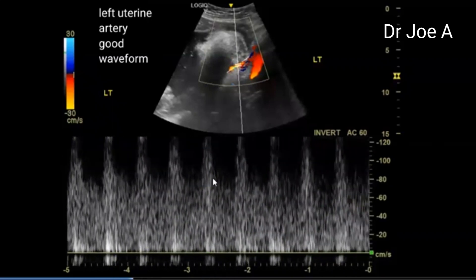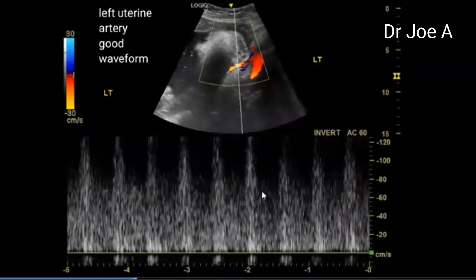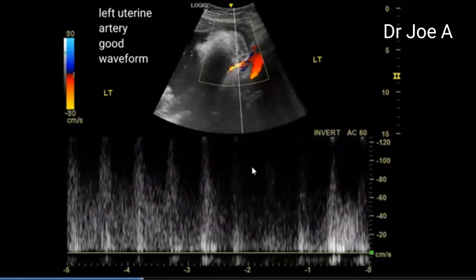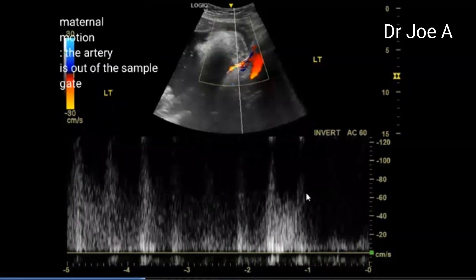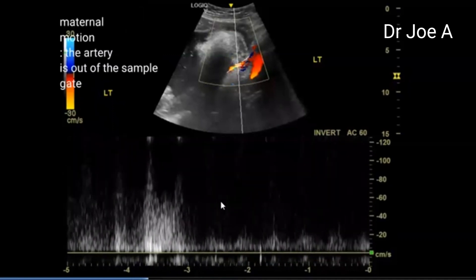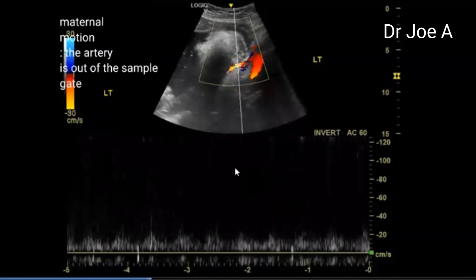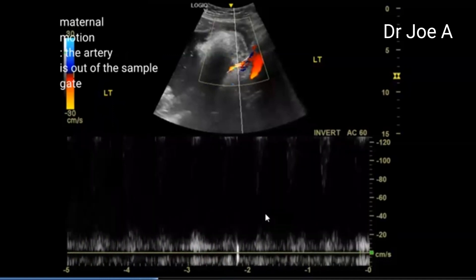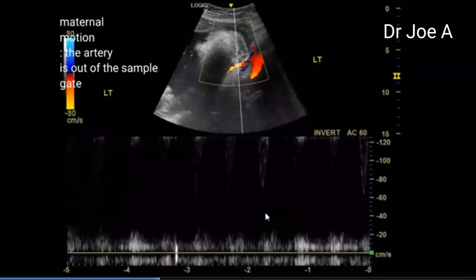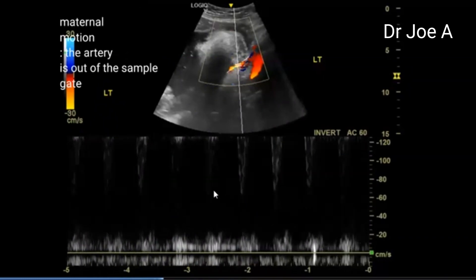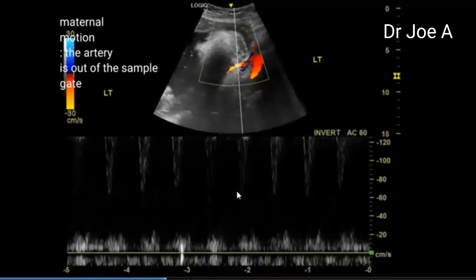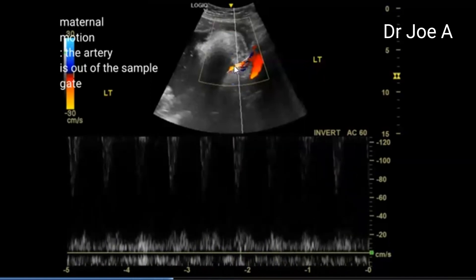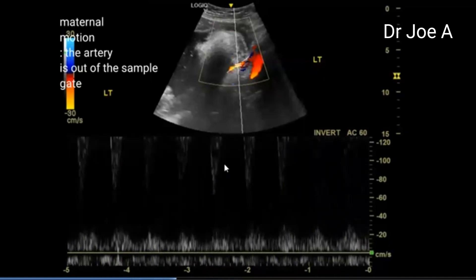As we continue, the waveform is good with a lot of diastolic flow and good systolic flow. The uterine artery has now slipped because of transducer movement — the mother kept fidgeting a little bit, feeling uneasy and not too comfortable in position. So we just wait for the correct position of the sample gate over the uterine artery.